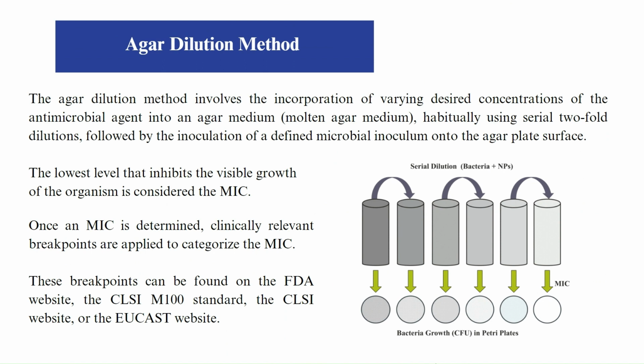Once an MIC is determined, clinically relevant breakpoints are applied to categorize the MIC. These breakpoints can be found on the FDA website, the CLSI M100 standard, the CLSI website, or the EUCAST website.